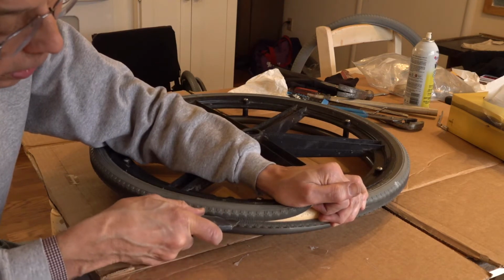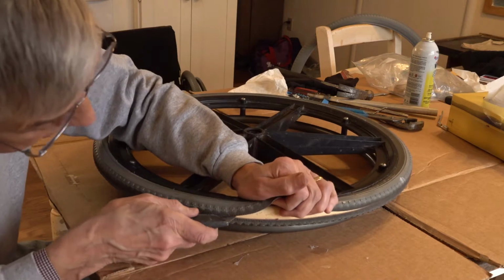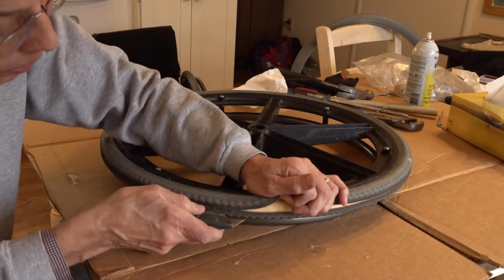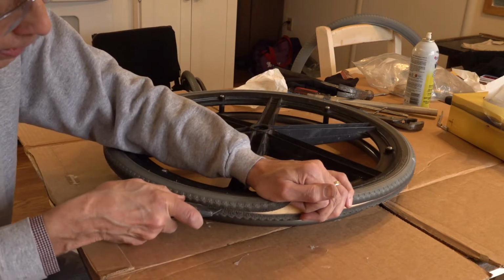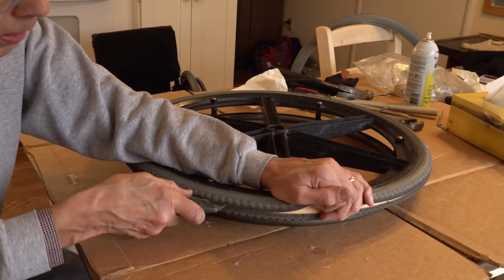The insert has a little groove in it, in the middle of it, so if we cut into that, it's not going to damage that. In fact, it assists us a little bit to get a cut on the old tire.